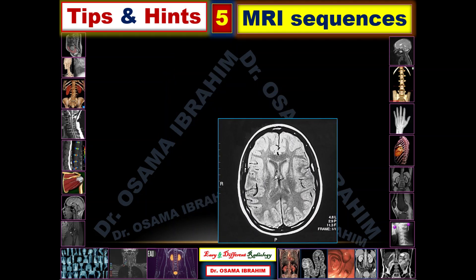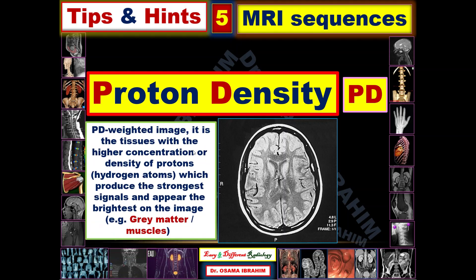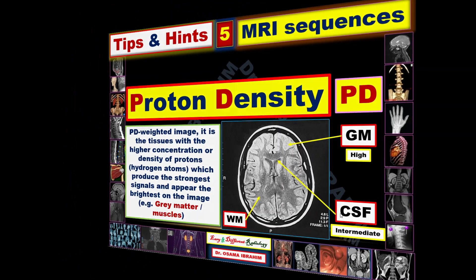This sequence shows CSF appearing as intermediate signal. The gray matter appears brighter than other tissues because gray matter has a high concentration of protons. This sequence is therefore dependent on the proton concentration level, so it is called the proton density sequence. Proton density imaging depends on the high concentration and density of protons within the tissue. Gray matter and muscle have high concentrations, so they appear brighter, as shown by the arrow pointing to the cortex with high signal compared with the lower signal of white matter and intermediate signal of the ventricles.